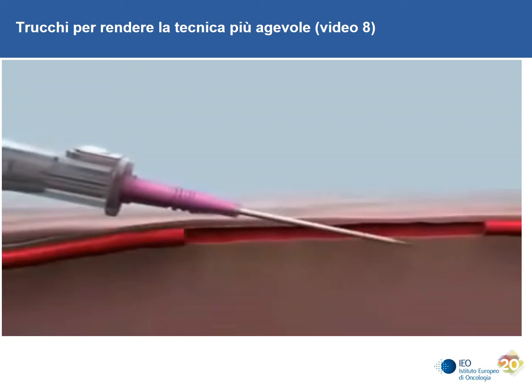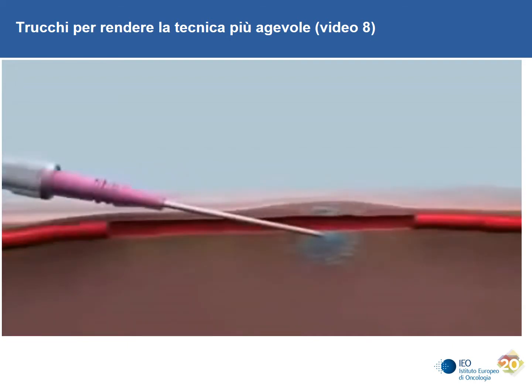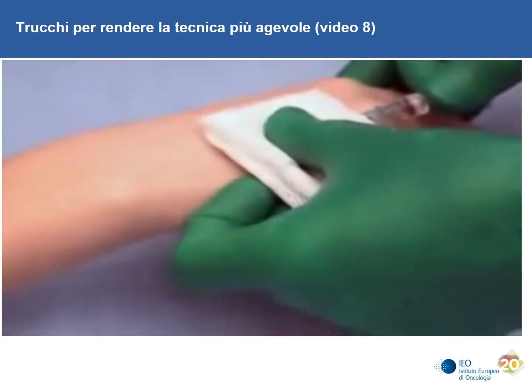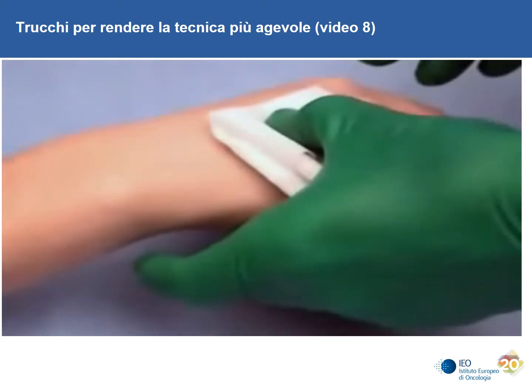Occasionally, it is possible to advance the catheter when it is outside the vein or when the catheter has perforated the vein's opposite wall. Either of these situations can cause pain and swelling at the insertion site because the intravenous fluids are administered into subcutaneous tissue. When this occurs, the cannula should be withdrawn completely, and another cannula should be placed at an alternative site. When a cannulation attempt is unsuccessful, the subsequent attempt should be performed in a vein proximal to the initial puncture site.